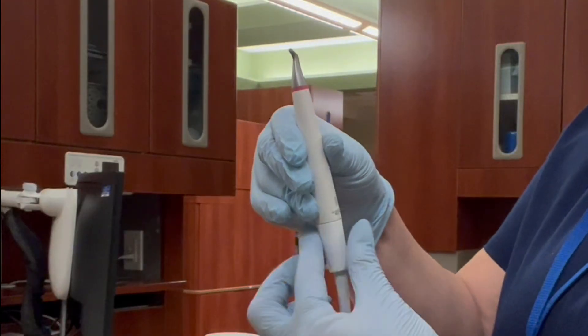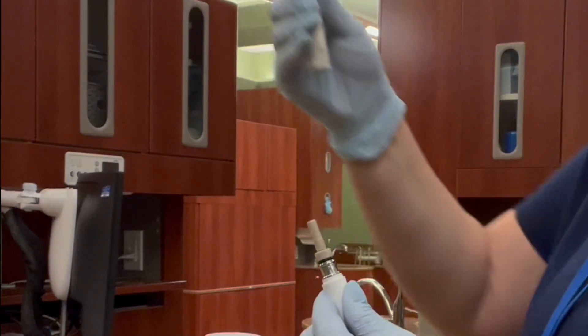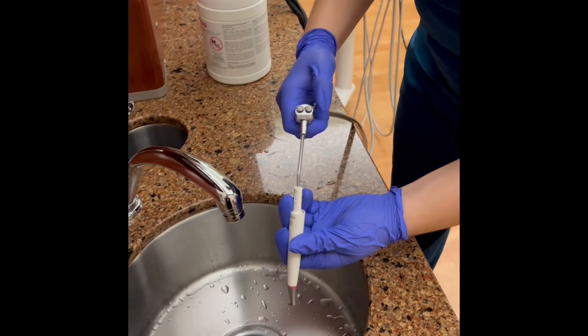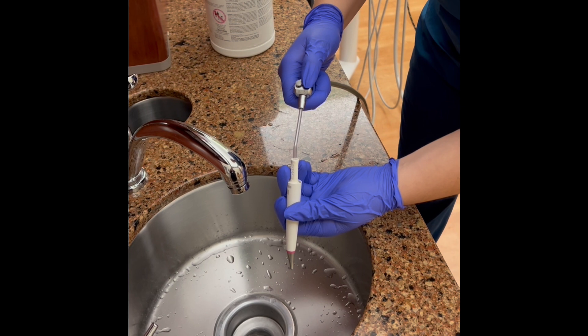Remove the Airflow handpiece by holding the connector firmly in one hand and pulling them apart. Insert the plastic easy clean device into the handpiece. Rinse thoroughly with the air water syringe and then dry thoroughly with air.